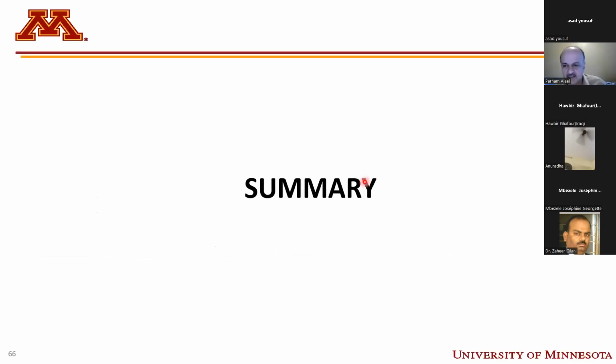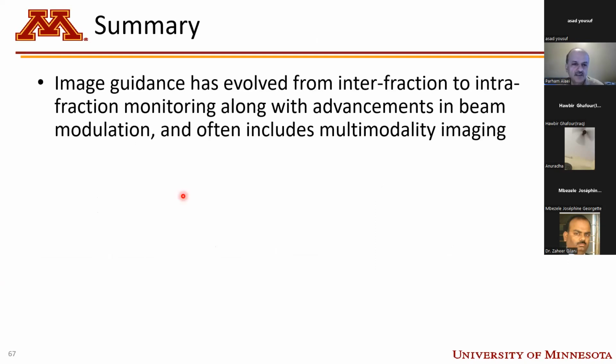So moving on to the summary. In summary, image guidance has evolved from interfraction to intrafraction monitoring. I mentioned the CyberKnife, the MR Linac, and all that. Those are capable of doing intrafraction monitoring. And this advancement has come along with the advancements in beam modulation, and often includes multimodality imaging.